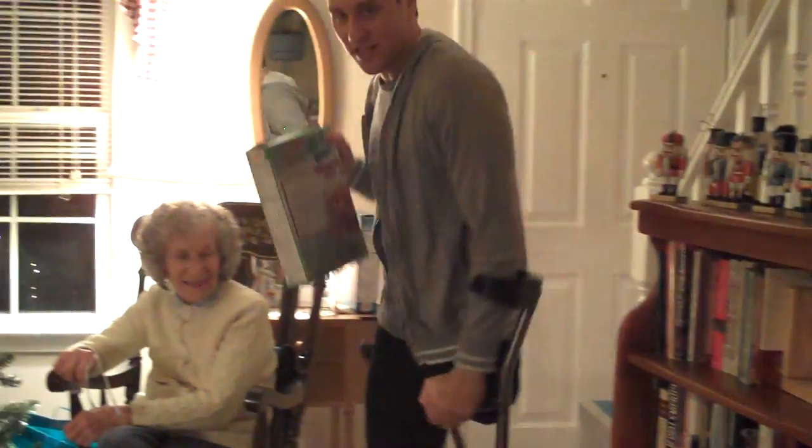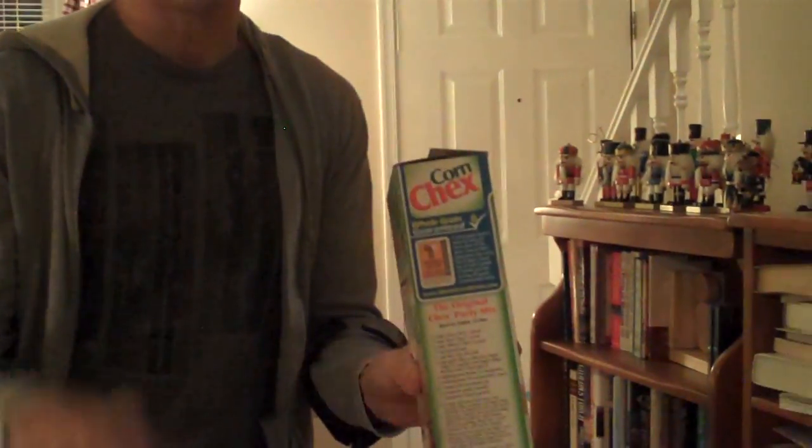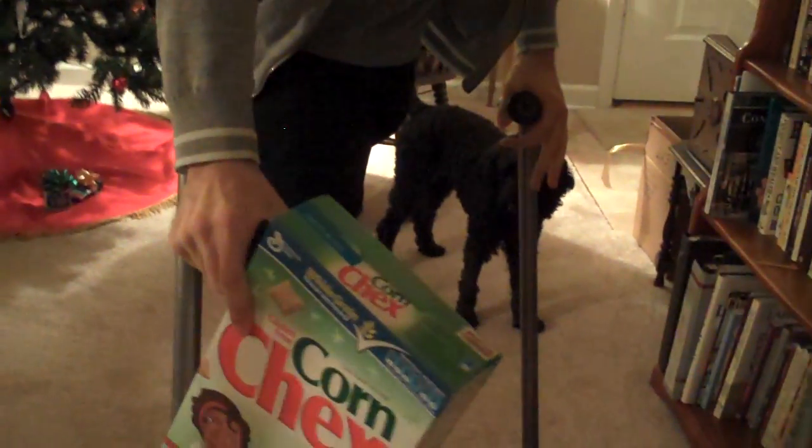Now let's say that you have something that does not have handles on it. Here's our next move: it's going to be the grip. Let's say we have this box of cereal. Take these two fingers, put it around the item, and then put the rest of your hand over the crutch. When you walk, you just lean your hand on the crutch and hold the box with the other two fingers.